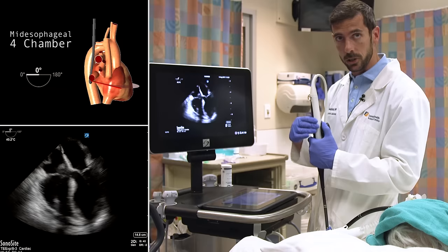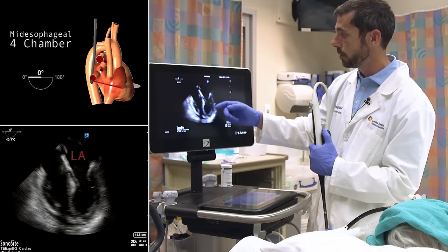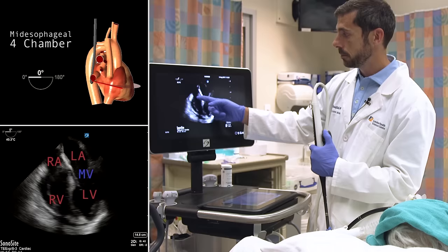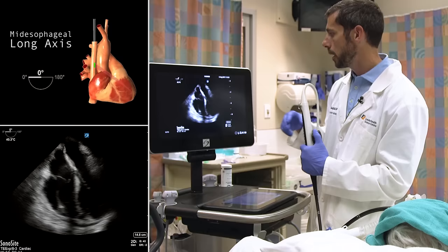The crystals are at zero degrees with no manipulation of the multi-beam function, and we're in the mid-esophagus. The default view is the mid-esophageal four-chamber view. The structures of interest are the left atrium, left ventricle, mitral valve, right ventricle, right atrium, tricuspid valve, and pericardial space — very similar to the apical four-chamber view in transthoracic echocardiography.